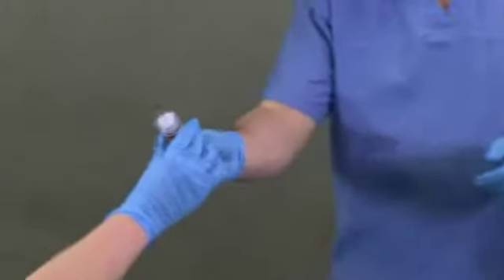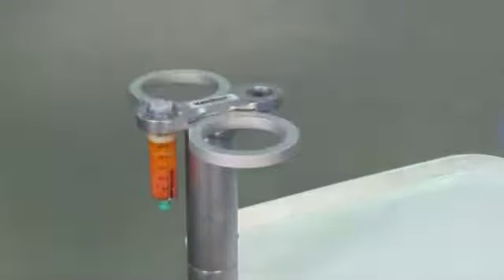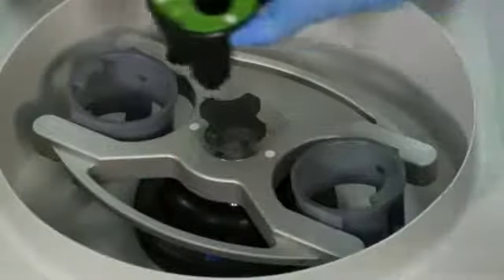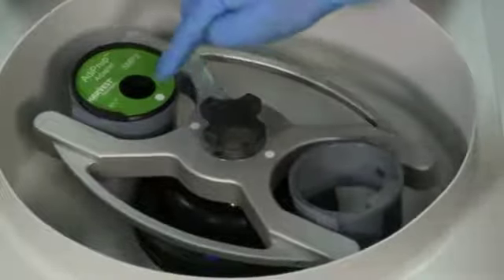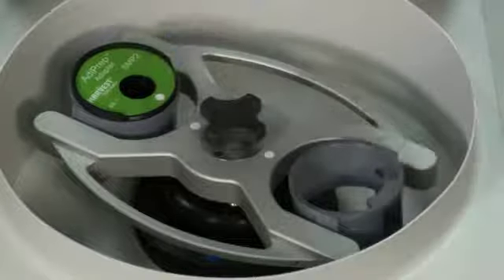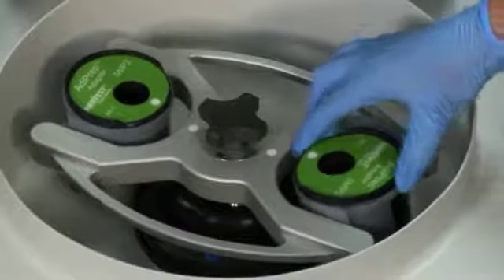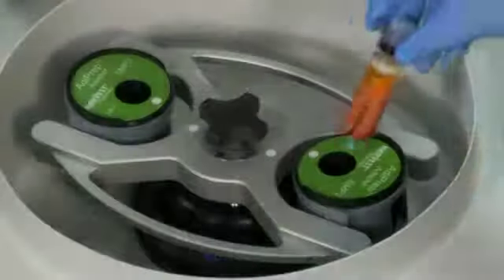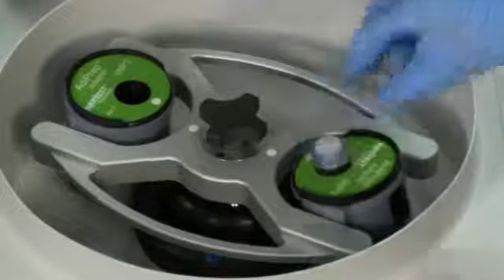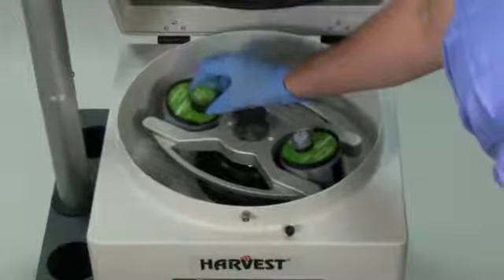The process disposable may now be passed off the sterile field for processing on the SmartPrep device. Open the lid to the SmartPrep centrifuge and insert the AdiPrep adapters into each trunnion. Align the white dots on the adapters and SmartPrep rotor to ensure a proper fit. Place the processing disposable, green tip cap pointing down, into the sample holder in one of the adapters. Place the green balance weight into the sample holder in the remaining adapter.